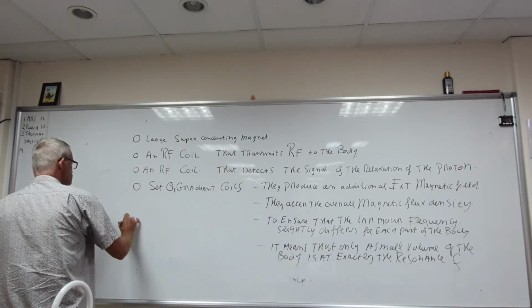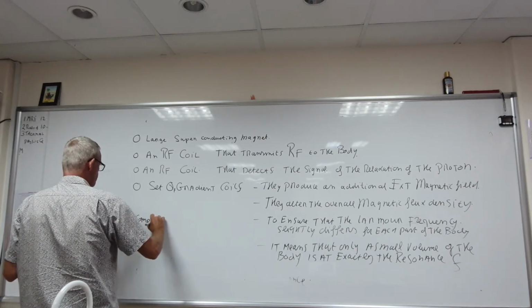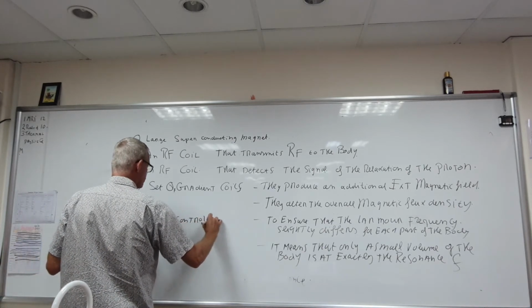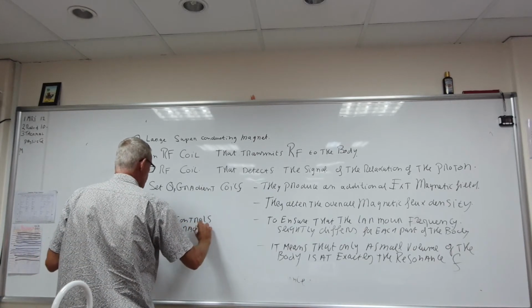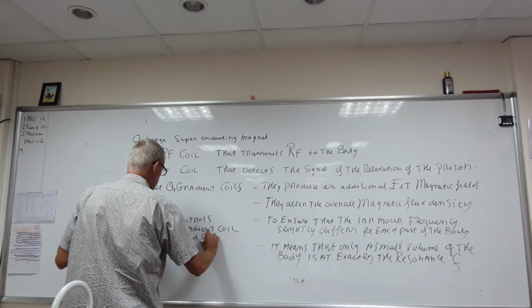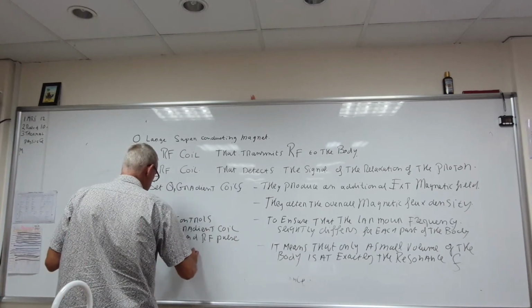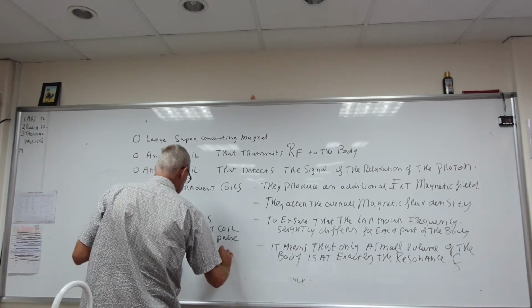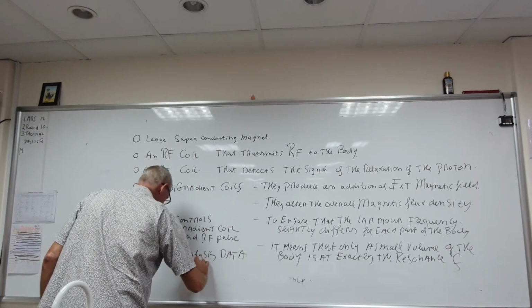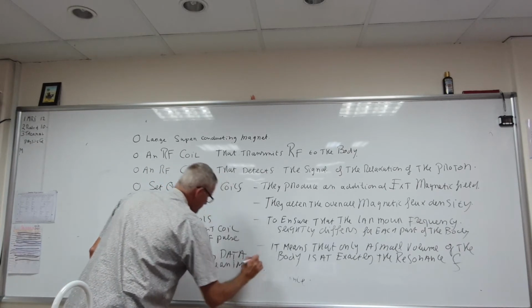Now, the computer, what does the computer do in all this? It controls gradient coils and RF pulses, okay, and of course analyzes data to produce the image, yeah?